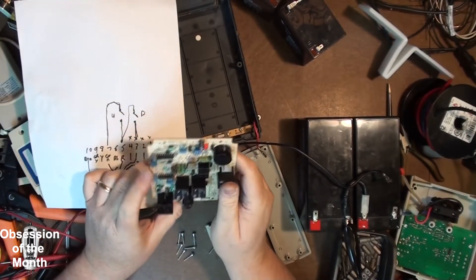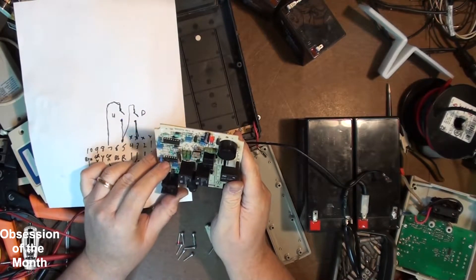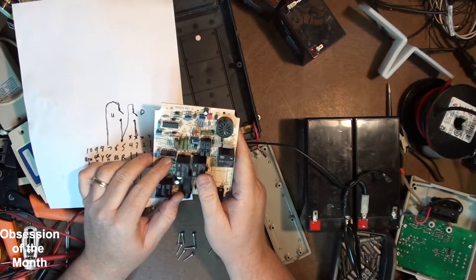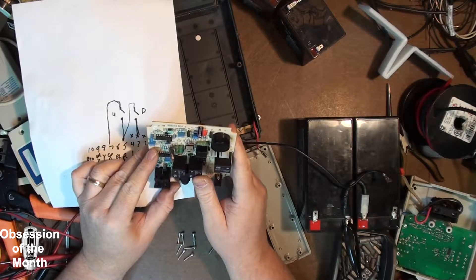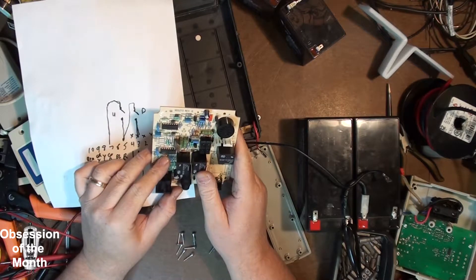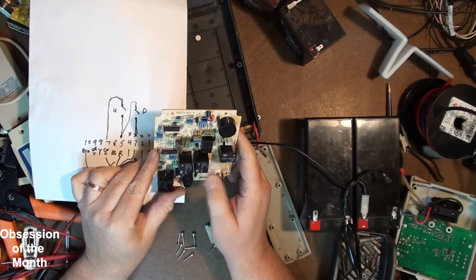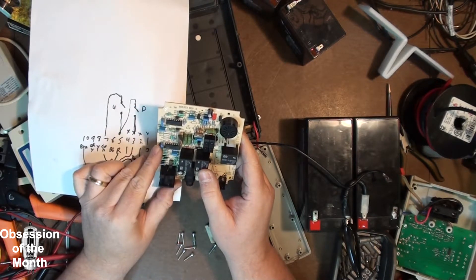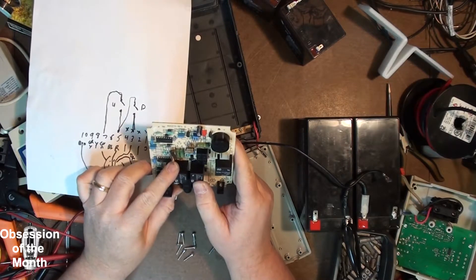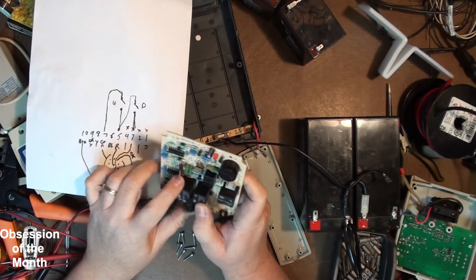Before I went and ordered any batteries or did anything, I did some testing and I couldn't get the lift to raise. It would go down but it wouldn't go up. I did some testing and found that this relay is bad — it won't engage. So I'm going to have to order that, unless I've already got one. I'll look around.